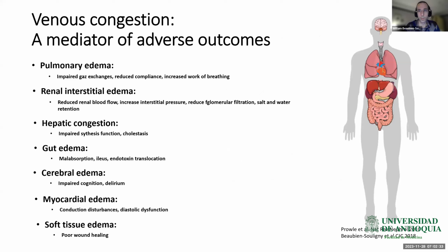So the success rate of the technique was excellent, from 98 to 100%. Distribution of femoral pulsatility is presented here. So pulsatility was present in 20% of patients pre-op, 31% post-op day 0, and 44% at day 1.